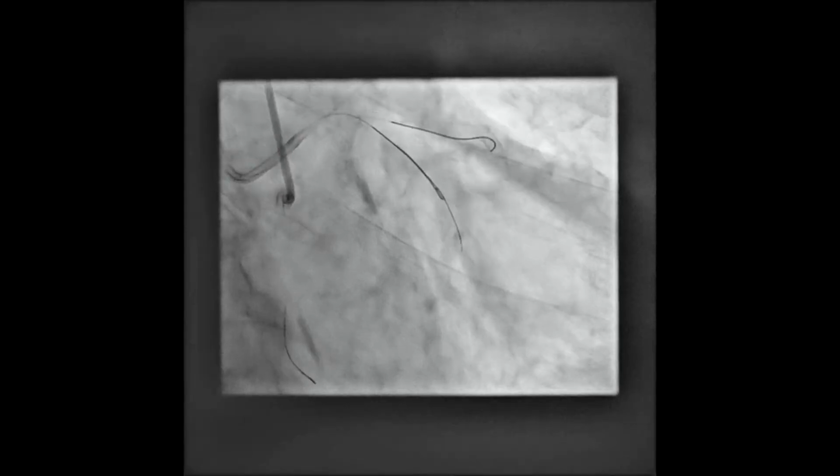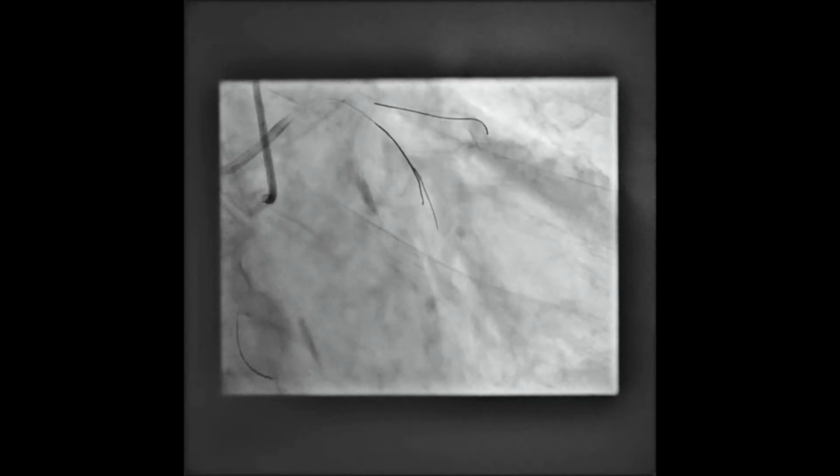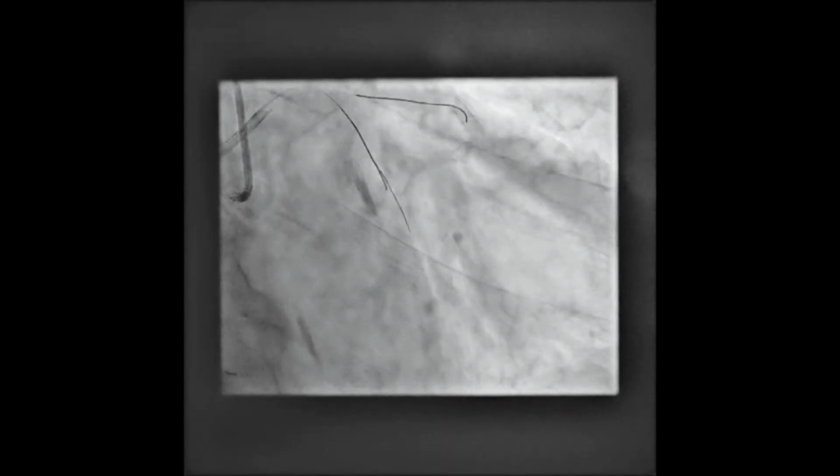So in this situation, we advanced a dual lumen microcatheter into the extraplaque segment and advanced another tapered hydrophilic wire through the side port in a parallel wire fashion, knowing that the first wire was extraplaque, so hopefully staying a little bit to the left of that.